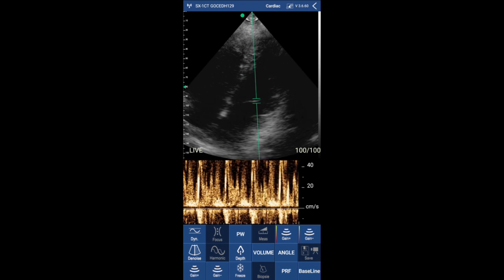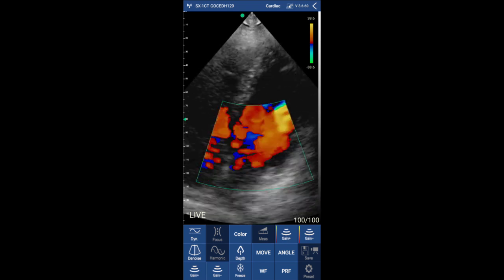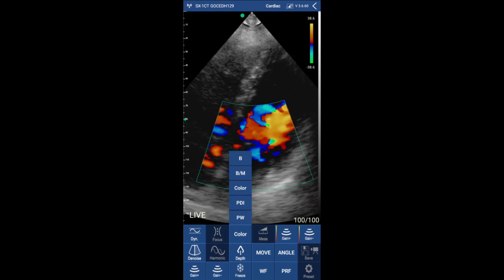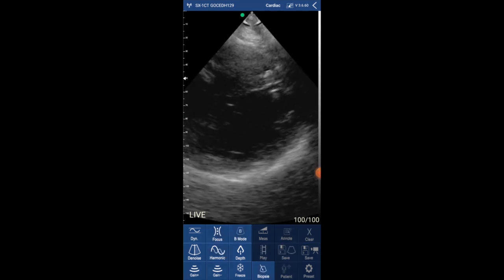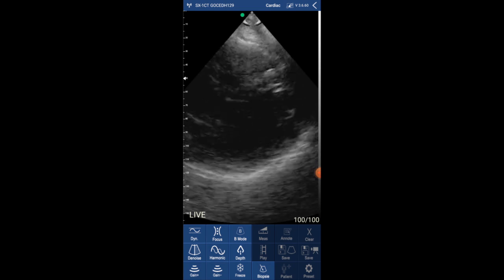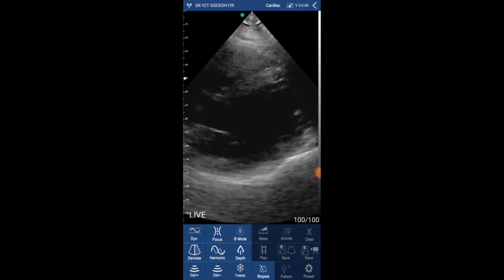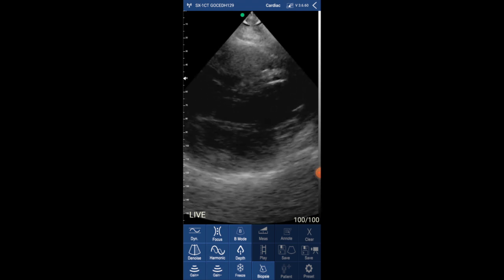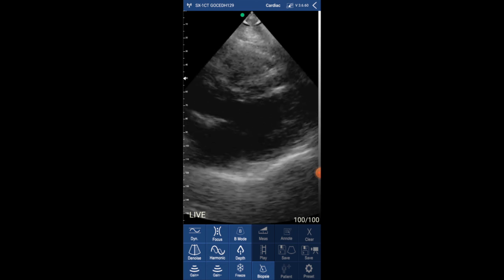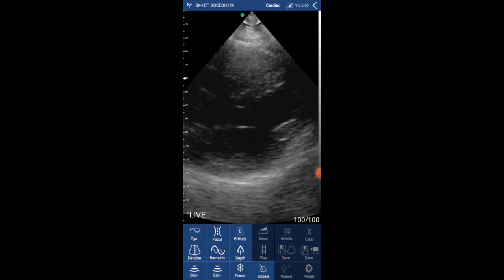Now I'm placing the color Doppler on top of the mitral valve. Now I'm showing you some subcostal views — here you can clearly see the endocardium and the left ventricle, the mitral valve and the aortic valve. What do you think so far about the image quality and all the ultrasound tools you can use with this app?